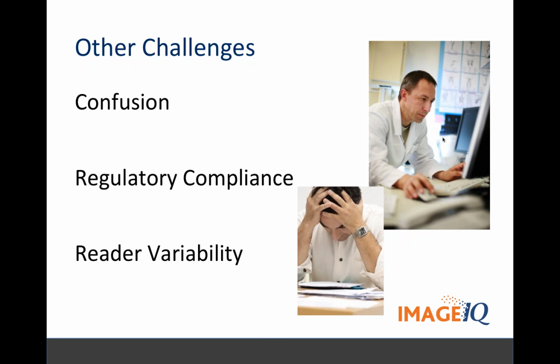Probably our biggest webinar we've ever done was compliance in imaging. It was a couple, 3 years back. It was a while back, but just the challenge around being compliant in imaging and you've got to manage the audit trail. And the systems. Andrew, we talked about this even on the rehearsal, right? The systems that you use for diagnostic clinical care radiology are designed for a different workflow than what you are doing in clinical trials and that kind of research.